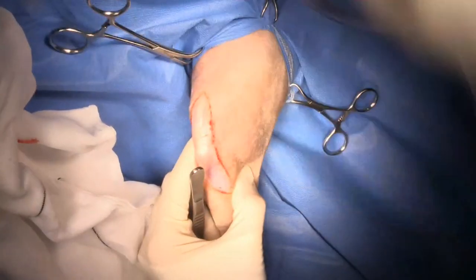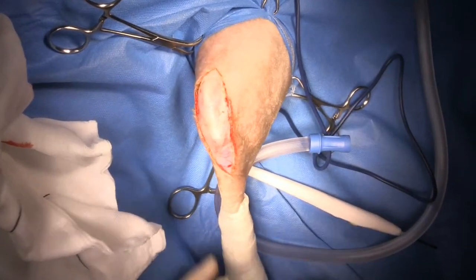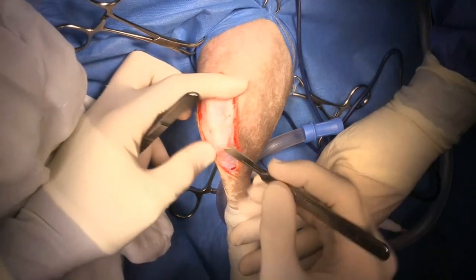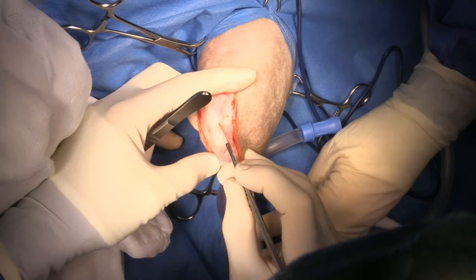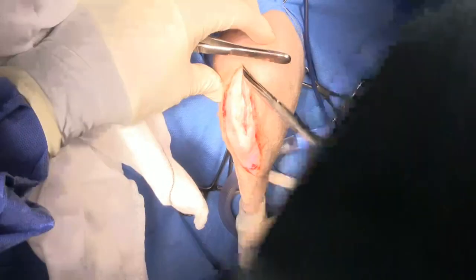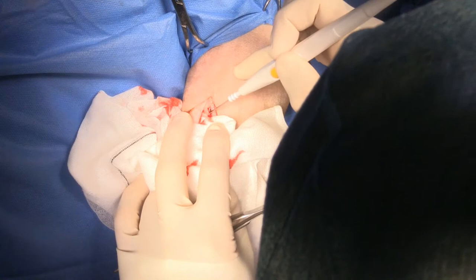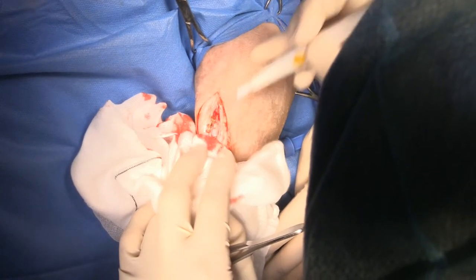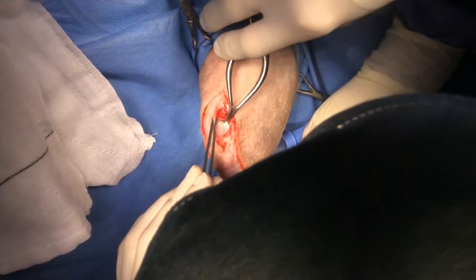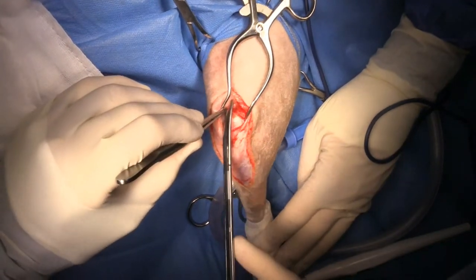The first thing I'm going to do is examine the cruciate ligament. I'll keep the stifle in slight flexion, then make a little stab incision right next to the patella tendon with a blade and do a push cut to open up the joint. When I do stifle surgery I really like to use Gelpi retractors - I think they're just so important in order to get the exposure that you need.